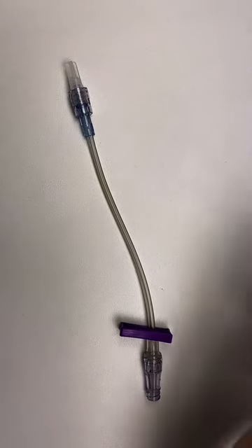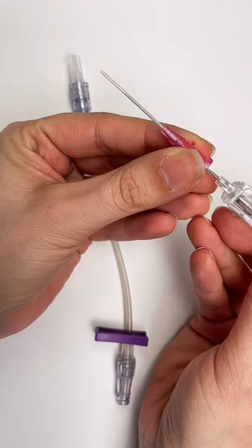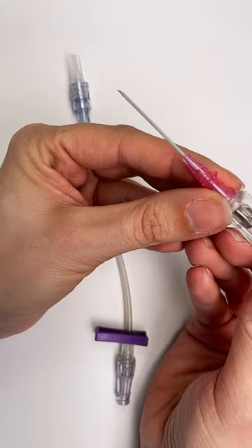If you are about to start an IV, I want to show you that this is the IV catheter, which is on top of the needle here. As you can see, the catheter itself is not actually very long, but the catheter is what needs to stay behind in your patient.